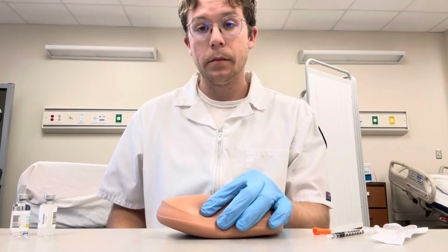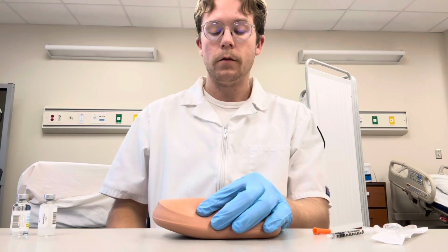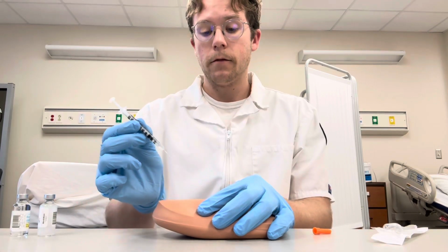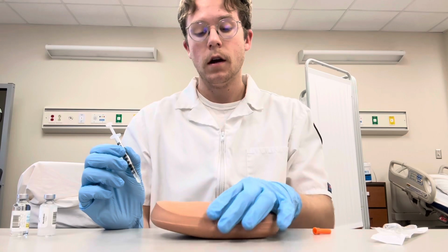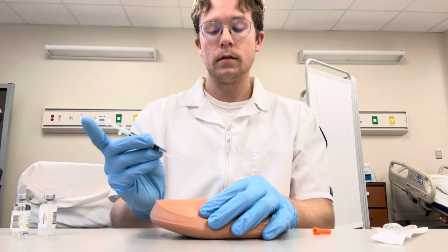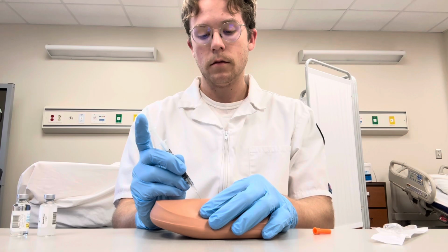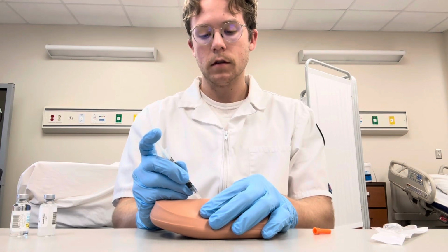Now we'll pinch up the skin for a sub-Q insulin injection. Now if we get 1 inch of skin pulled up, which we have now, we'll go in at a 45-degree angle. Now if we got 2 inches, which would be more, we could go in at a 90-degree angle, but for this insulin injection, we'll go at 45 degrees. And administer slowly.